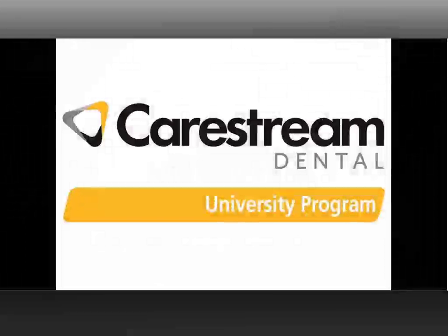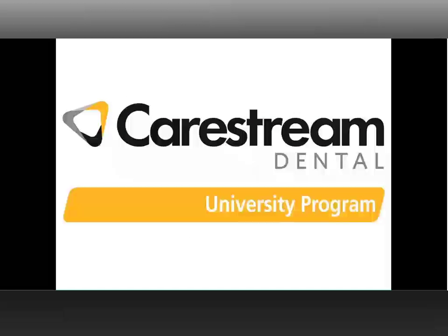Dr. Katal, before you begin, I'd like to introduce you. Dr. Shalise Katal is an oral and maxillofacial radiologist. He trained at the University of Missouri, Kansas City, and is a clinical assistant professor at New York University's College of Dentistry, where he operates all advanced imaging services. Dr. Katal is currently the Director, 3D Imaging for Carestream Dental. Dr. Katal, welcome, and thank you for taking the time to join me to do this review.